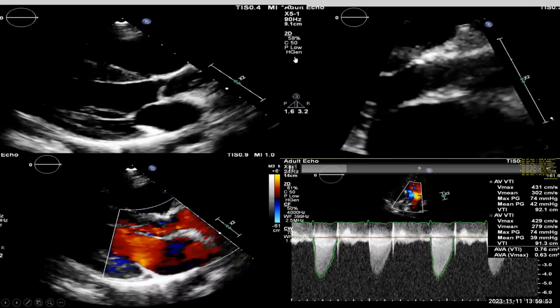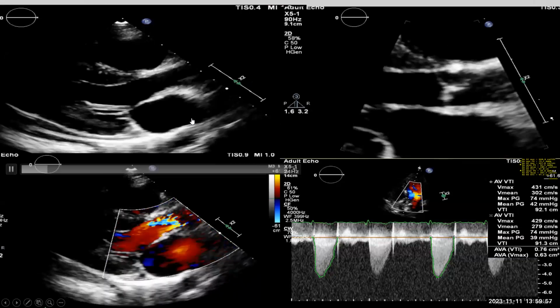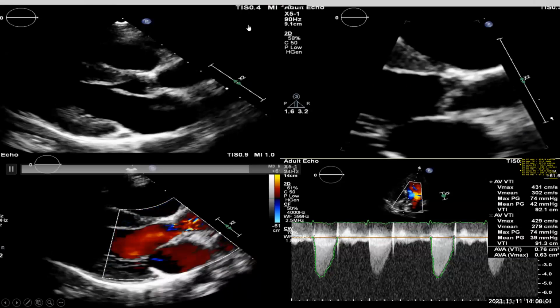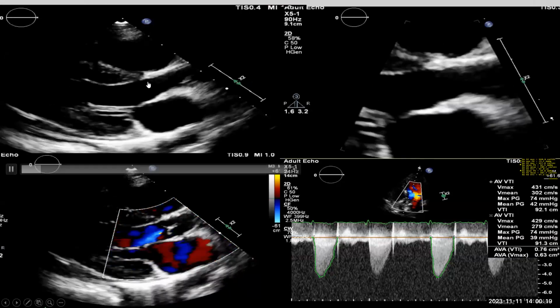So what could be the cause? You can see aortic valve opening is clear and there is no flow acceleration across the aortic valve. Excellent. It's supravalvular. Somebody said subvalvular with membrane. Somebody else said supravalvular. So what do you think here? Is it supra or sub, and why? Subaortic membrane type. Now to know, yeah, it is difficult.